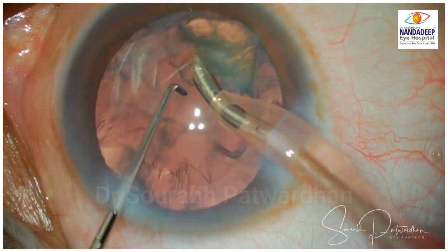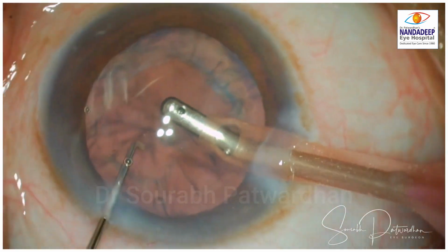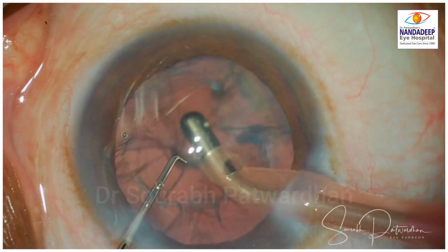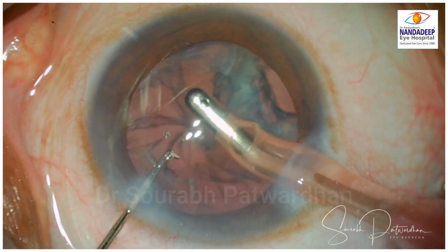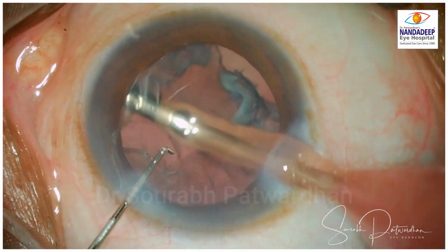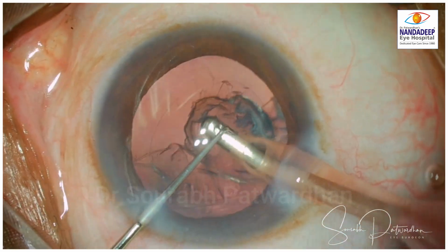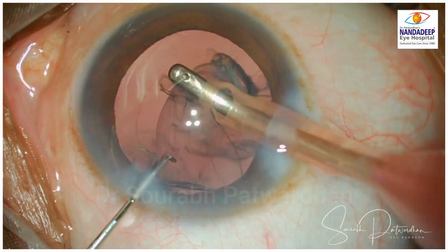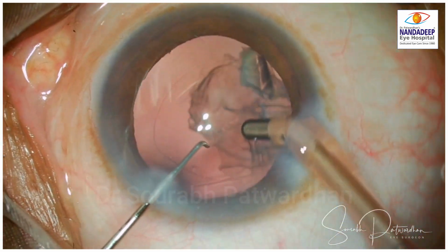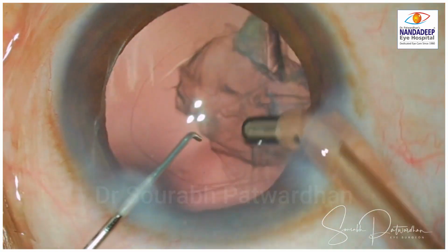Once the emulsification was done, I am going to move to cortex aspiration using coaxial IA. Again, a very regular response from the bag as I start the cortex aspiration, but as I move on to the area closer to the subincisional area, you find this happening. So we watch it again.